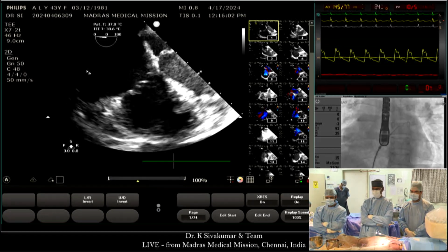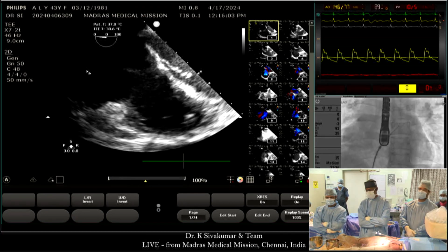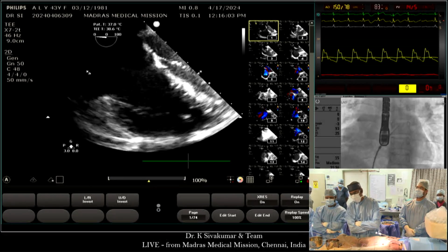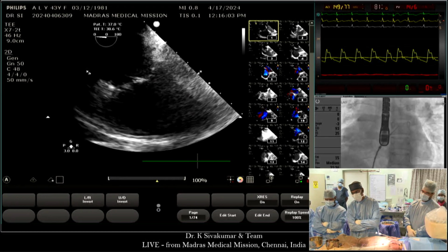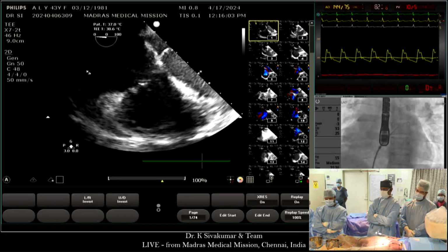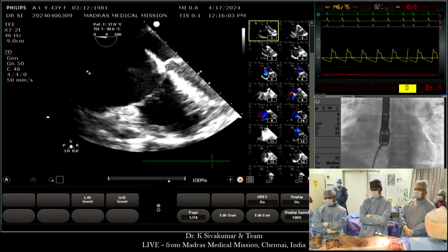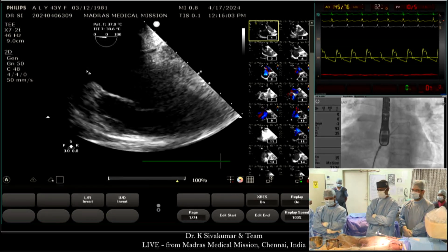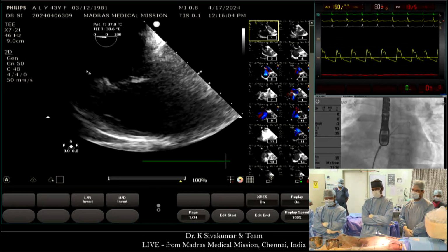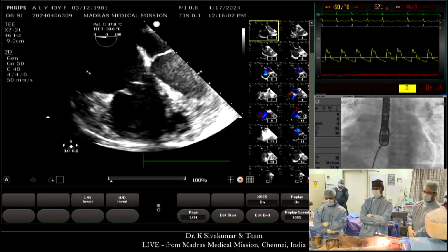Now, Zuhair, what would you do for the higher up vein? Would you reimplant it or leave it? There are multiple surgical techniques to deal with it. One of them is you can just divide the superior vena cava above that particular vein, close it, and reimplant the superior vena cava higher up into the RA, again using the atrial appendage. It can also be routed inside, and the SVC can be enlarged by patching. So there are multiple surgical techniques to deal with it.